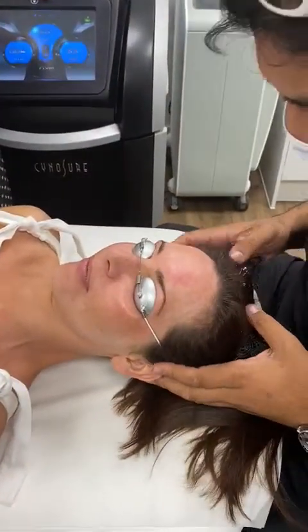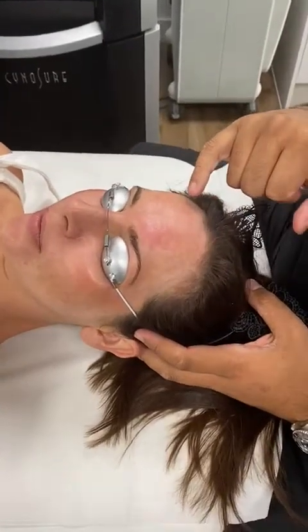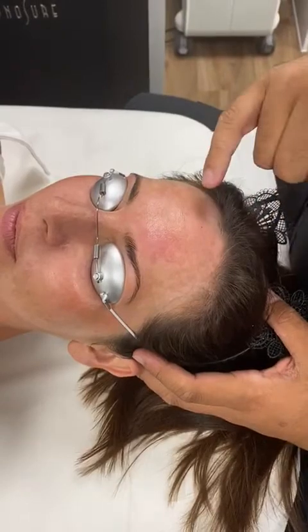So with our patient today, we are treating melasma. If you zoom in here, we can see the outline of this darker pigmentation here.